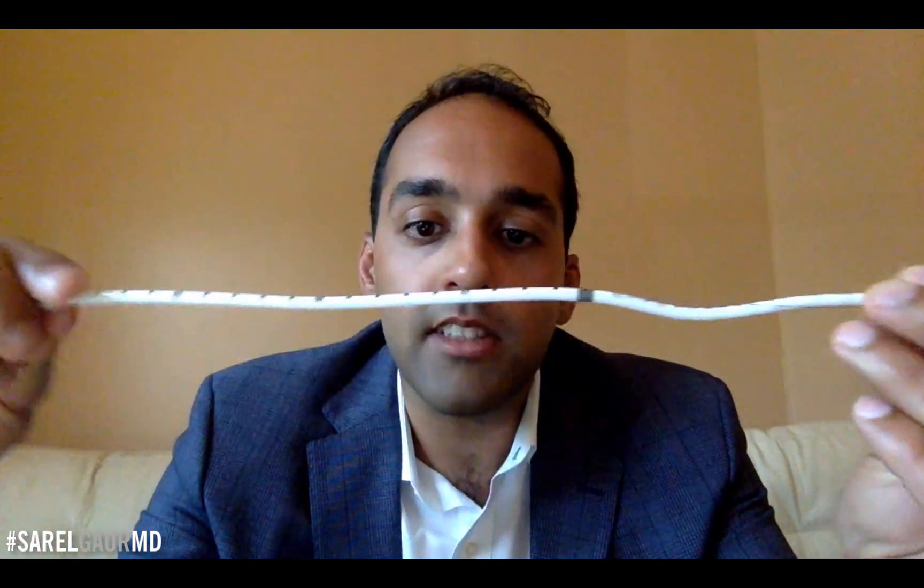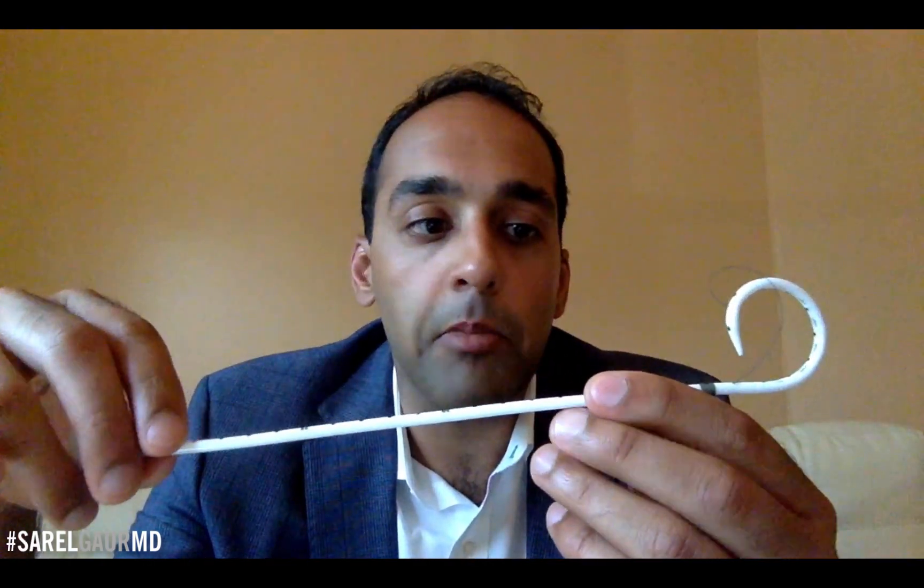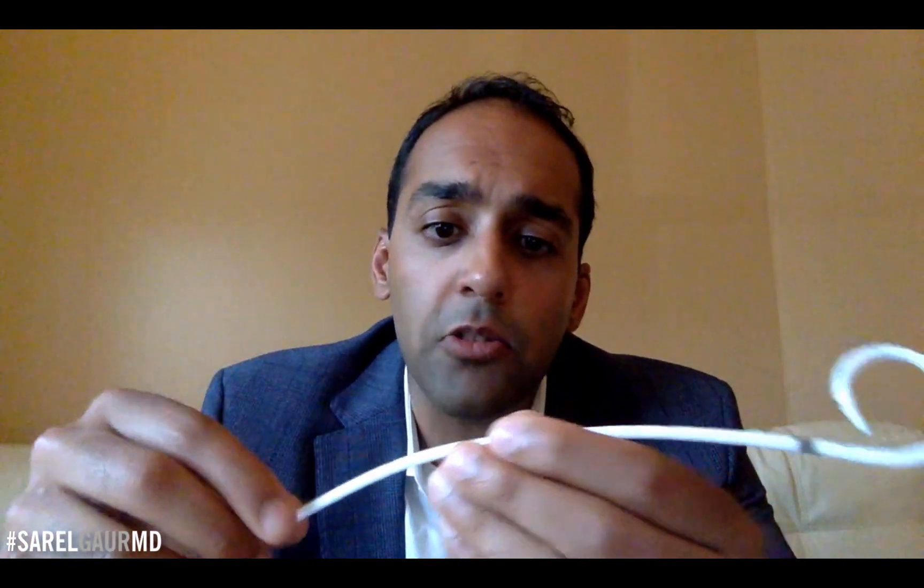You can see that the catheter naturally wants to coil up. This is the catheter straightened out, and you can see it naturally takes that pigtail formation. So now you actually see that suture is there — that suture is actually part of an internal suture inside the catheter that locks that loop.